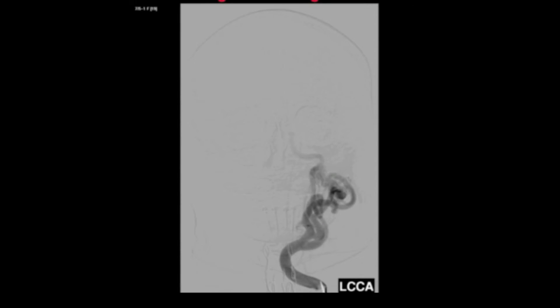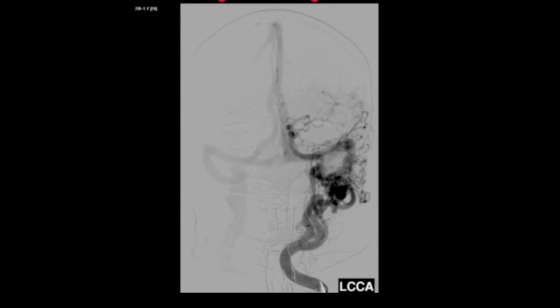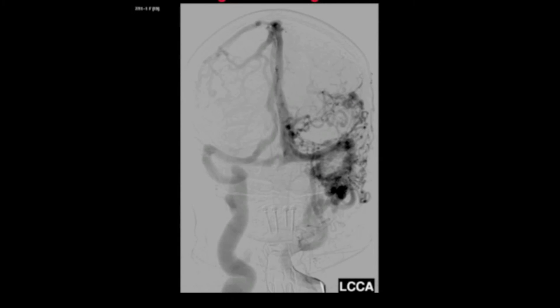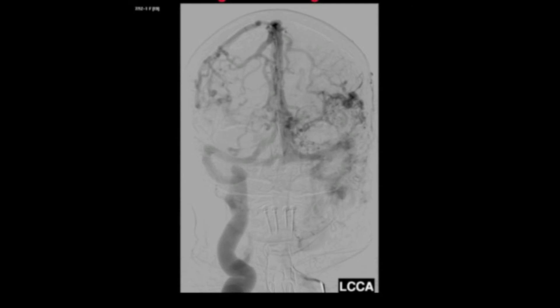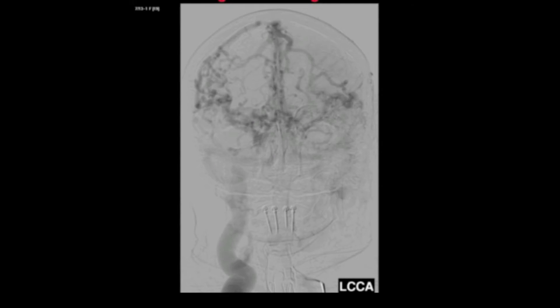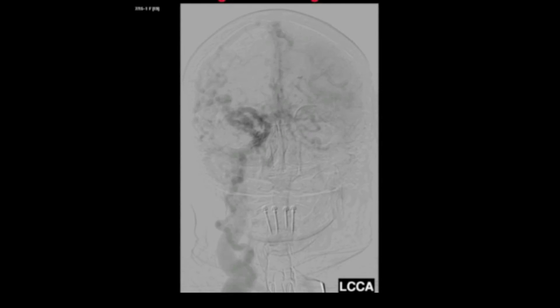The fistulous pouch tracks along the left transverse and sigmoid sinus, and critically, there is no jugular venous outflow on the left-hand side. There is substantial cortical venous hypertension.